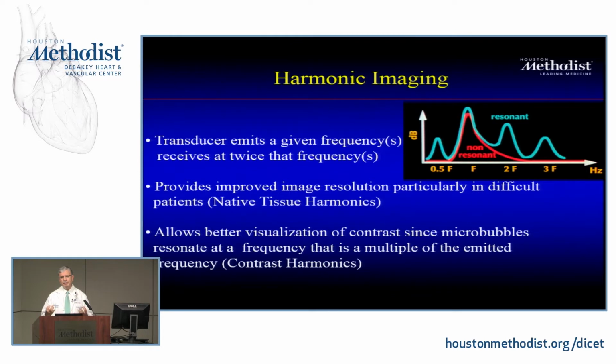Nowadays, most of our imaging is done with harmonic technology. If you tell me about one thing that has occurred in ultrasound that the adaptation was almost instantaneous, within 1 year, most of the imaging modalities have switched to harmonic imaging. It is harmonic imaging. And it was discovered, like many others, serendipitously.